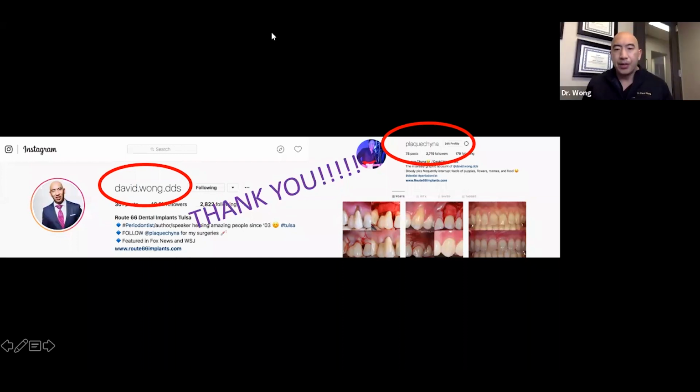Yeah, if that happens, usually it wasn't degranulated properly enough. So you still have a lot of granulation tissue in there. That happens. The other thing could be a different type of graft material. As an example, if you use a particle size that's too small, and we use small particle size graft materials all the time, but just not for sockets, it disappears too fast.